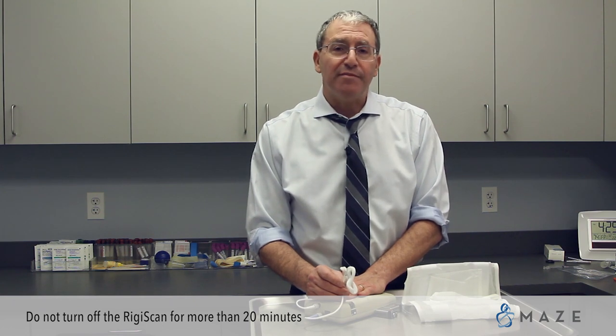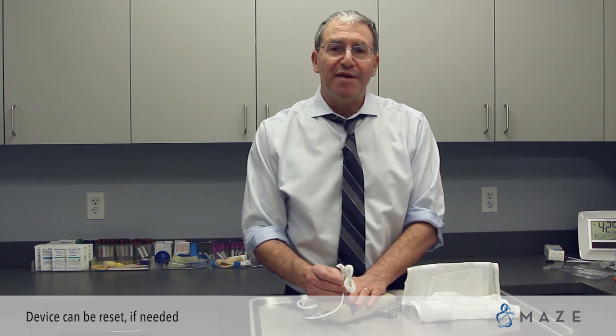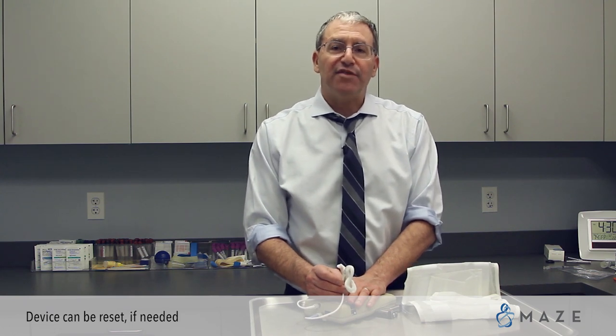Again, if there's any problem in the middle of this process, you can bring the device in. We will download the information that you have and set it up for you again.